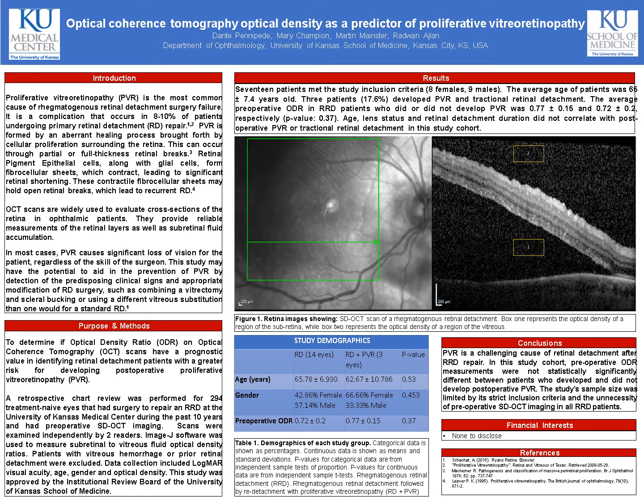Methods. A retrospective chart review was performed for 294 treatment-naive eyes that had surgery to repair a rhegmatogenous retinal detachment at the University of Kansas Medical Center during the past 10 years and had preoperative OCT imaging. Scans were examined independently by two readers.